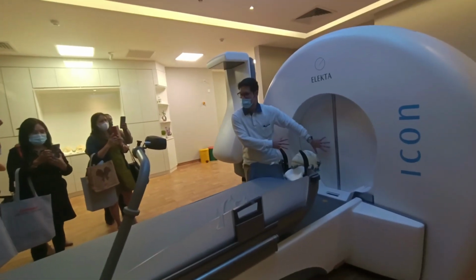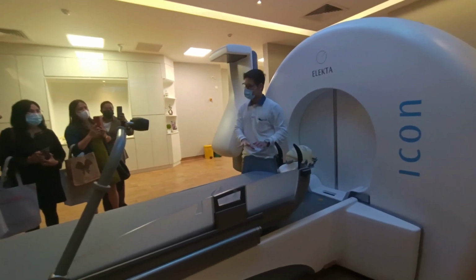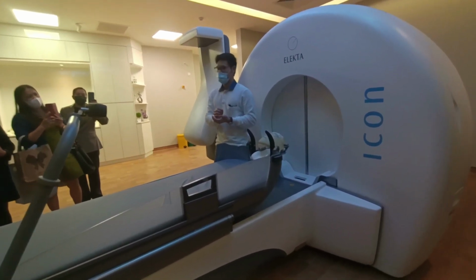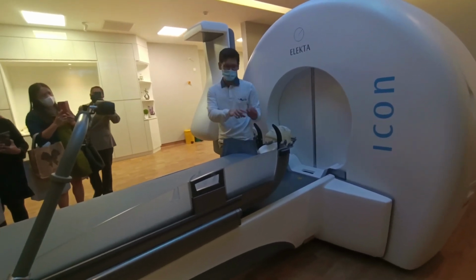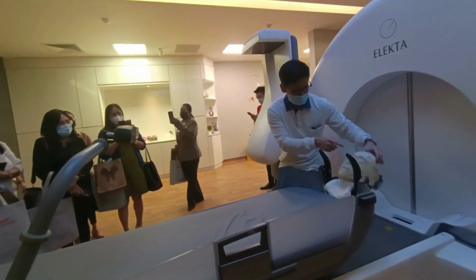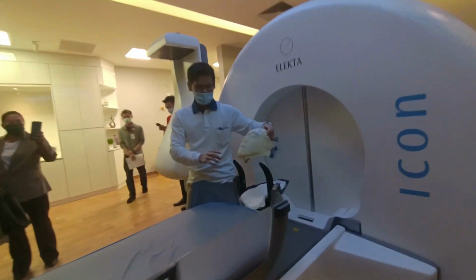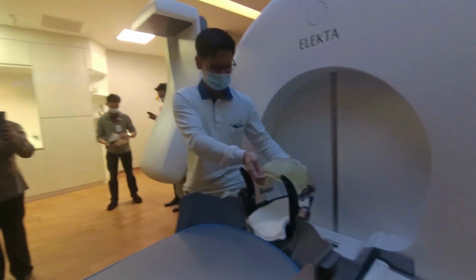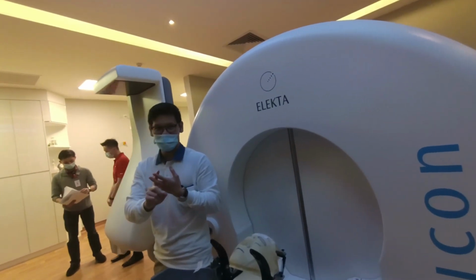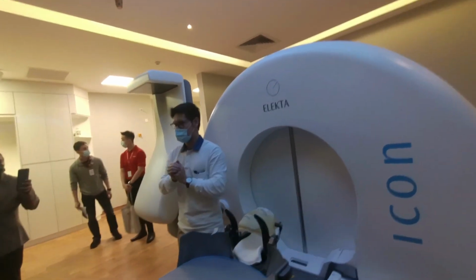This cup can only move so much inside. It's not very deep inside, so it's only targeted for the head. To position the patient correctly, you need the patient to be still, because this machine can achieve less than 1 millimeter precision. Even if the patient sneezes or coughs a bit, they will move. It's okay if the patient does that, it's natural. When it happens, you can detect it and the machine will shut off. This is the monitoring system. You see the silver thingy? It is detected by this one. If it moves out of tolerance, it will shut down. To secure the patient, we have a mask. We fix it in three positions so the patient's head is fixed and won't move. Then we're able to treat precisely and safely, because we want to target only the tumor and spare the eyes, the brainstem, and all the important nerves. So it's a very cool machine.